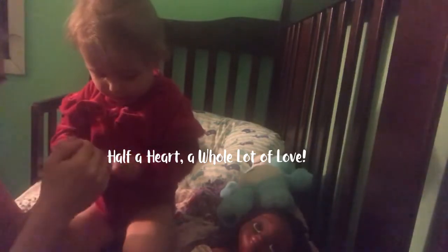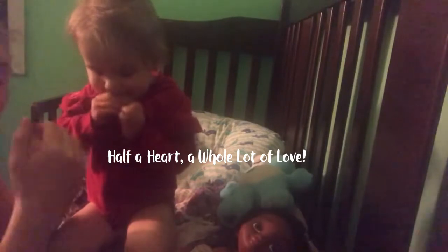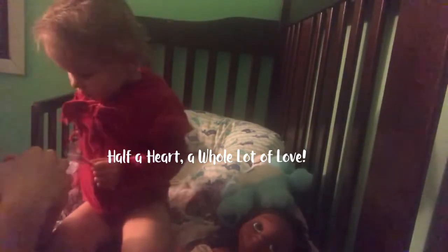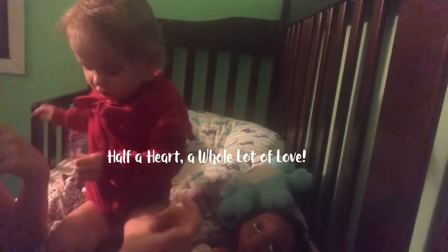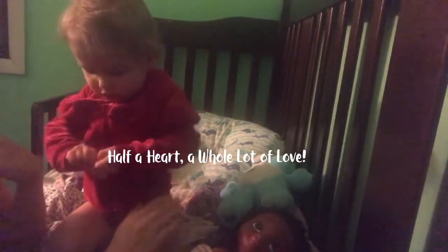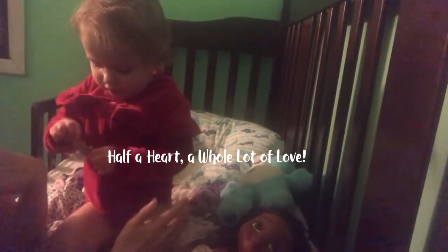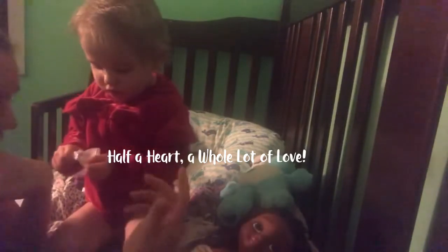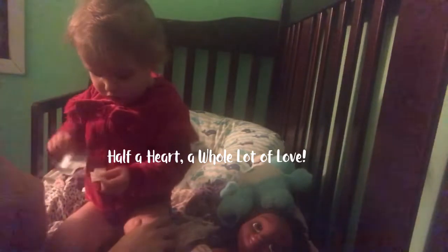Even in the hospital, I gave her Lovenox shots just because I felt more comfortable doing it myself than having other people do it. But again, you want to make sure that it goes subcutaneous, so it goes into the fat, which a lot of people go into the muscle, and that's how it can cause the baby to bleed out a little bit, which isn't the end of the world. Like I said, she didn't have a lot of fat. A lot of babies that are on Lovenox shots don't have a lot of fat, but try to get it in at a little bit of an angle. I believe it's a 45-degree angle. I'd have to look it up just to make sure.